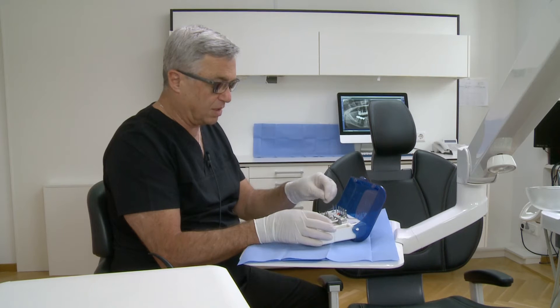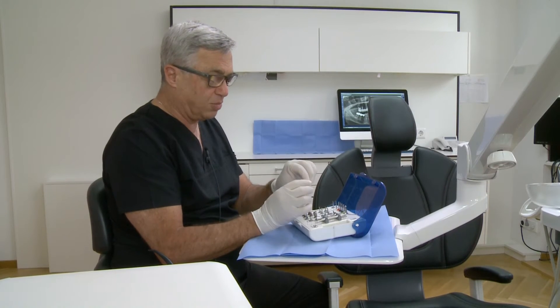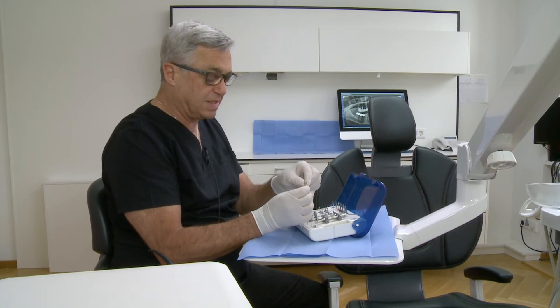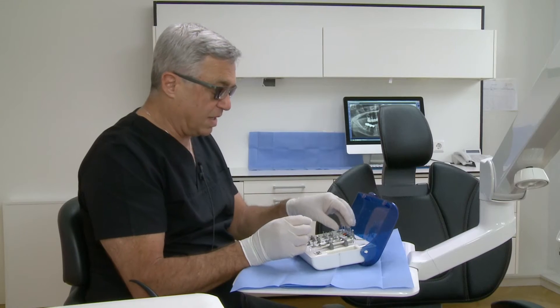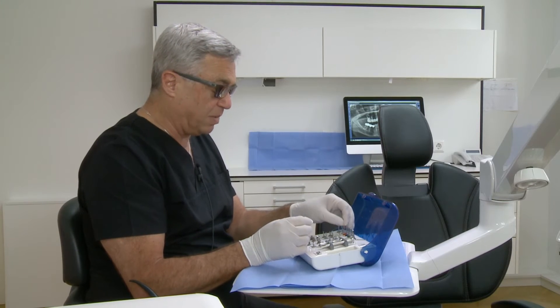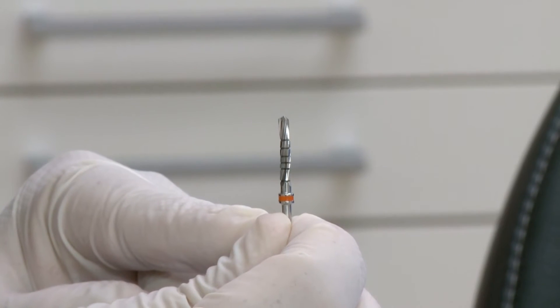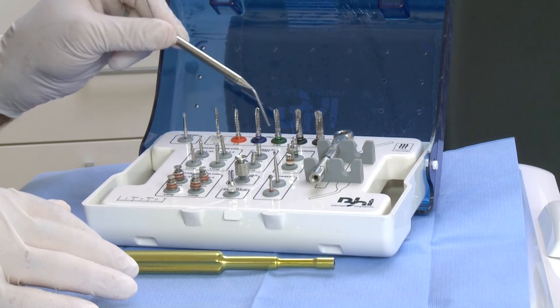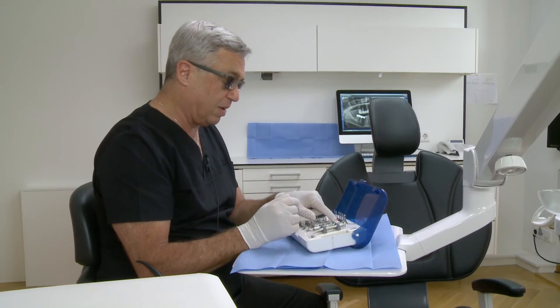After using the first drill, we use the paralleling post, inserting it in the 2 mm hole to check the parallelity of our implant and the bite. Then the next drill will be a 2.8 mm drill with the same length marks. The next drill will be a 3.2 mm drill for a 3.7 mm implant.